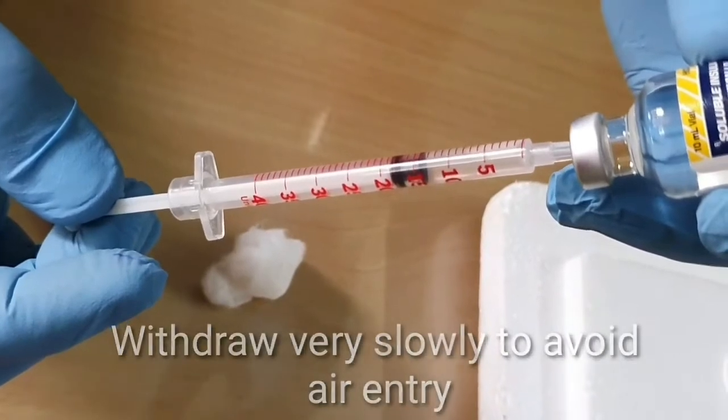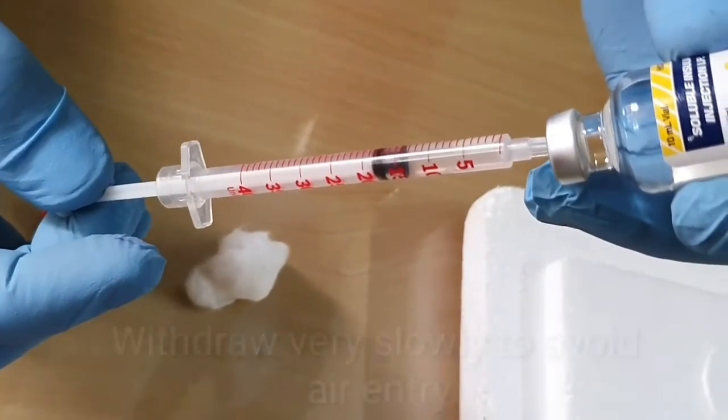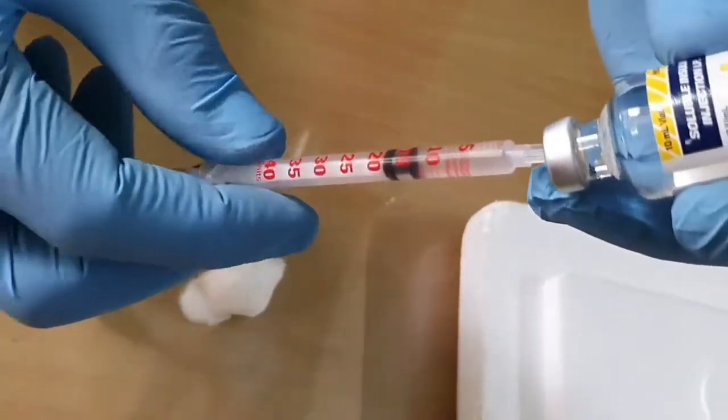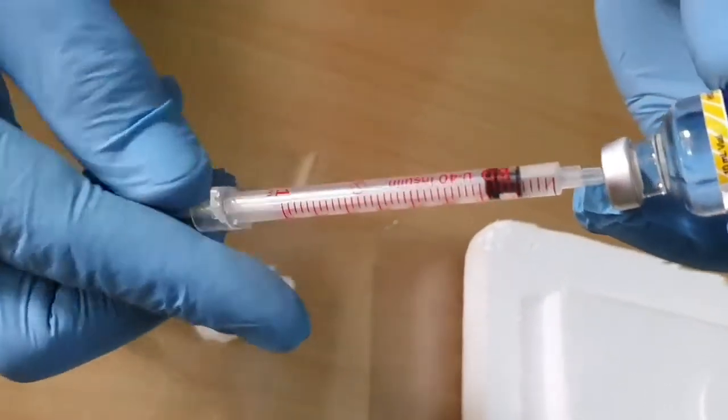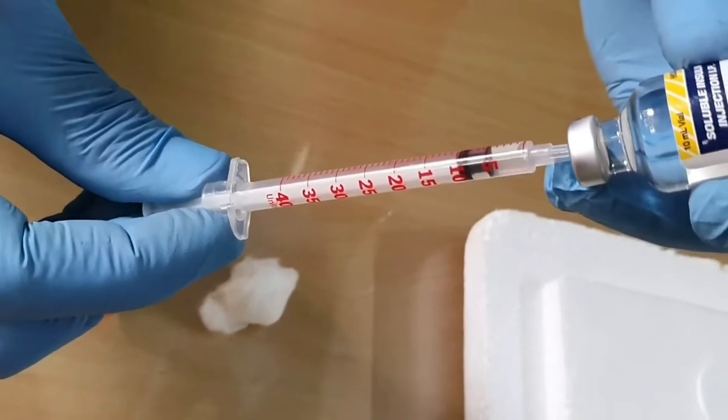So now I am at the 14 mark. Suppose at times if you withdraw faster there can be air. Now you don't bother. What you can do is push back the entire insulin back into the bottle and then slowly withdraw so that there is no air.